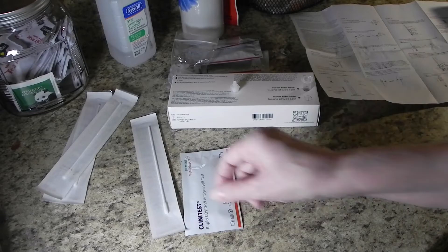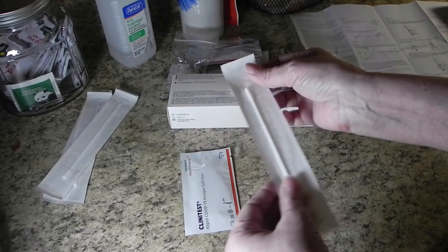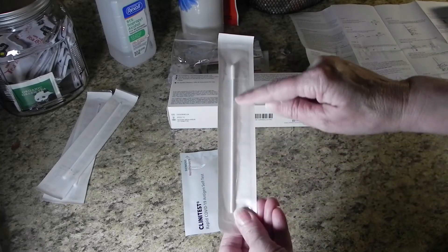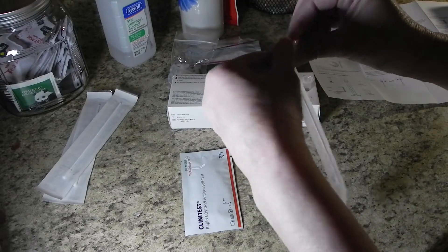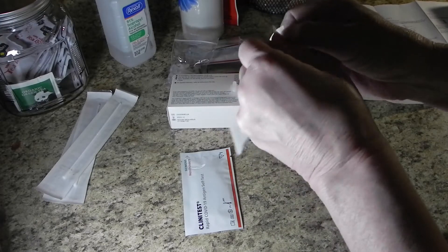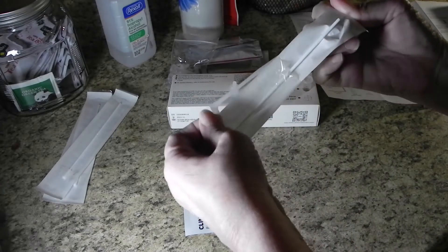Now it's time for the uncomfortable part, but with these home tests, it's not that uncomfortable. Notice where the Q-tip is at the top of the package. When you open it, turn it upside down so that you'll be pulling the Q-tip out by the handle and not by the tip.